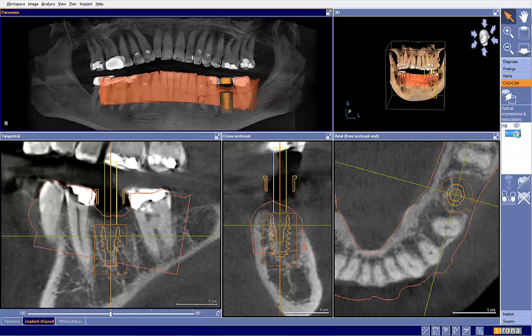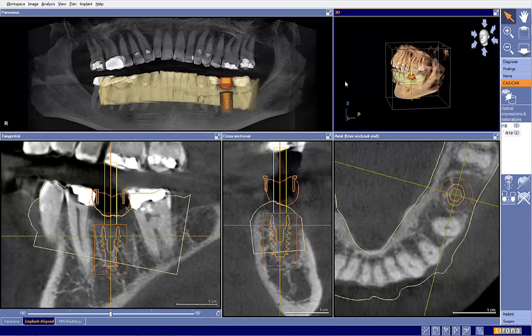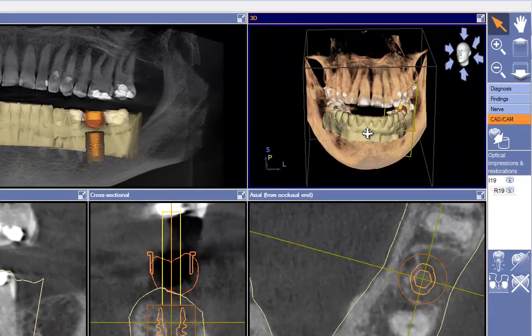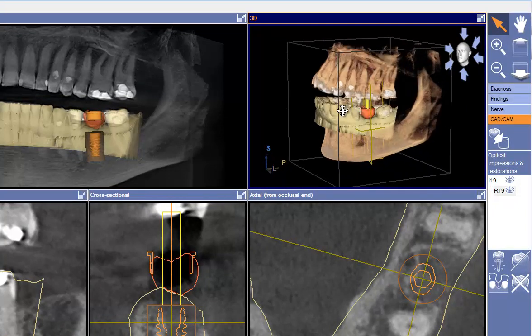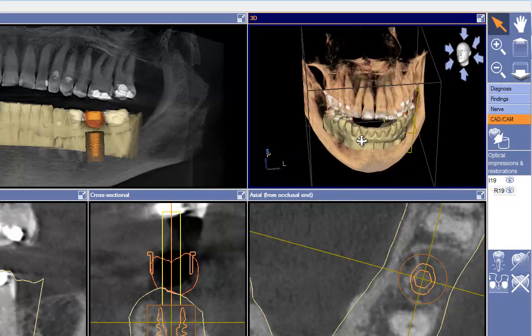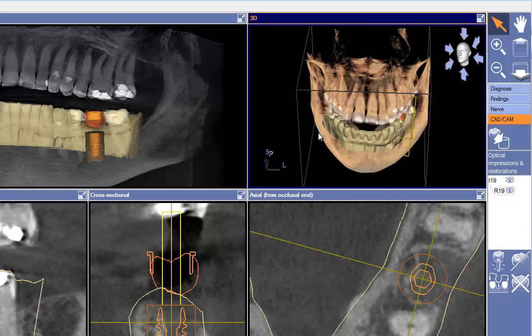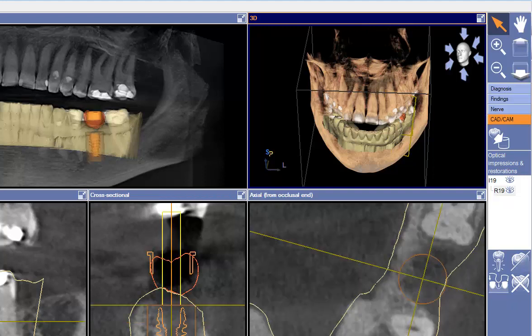So in this particular case, we brought in 3D data, so cone beam, and we also have a full arch CEREC scan that is very well integrated. So now we have all the data necessary to go ahead and fabricate an OptiGuide. So in this case, all we're really doing is looking at the plan itself. I went ahead and made a duplicate of the plan so we can compare your plan to my plan if there are any changes that we make.